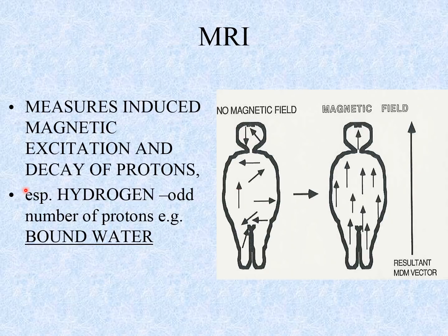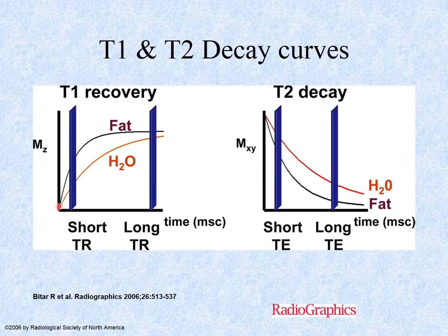Hydrogen is included. If you put the body in a field that has a very strong magnetic field, all of those bound water molecules are oriented in roughly the same direction. If you disturb those briefly, as you might a compass when you hit the needle, they will gradually reorient to the orientation of this field, and it's possible to detect that over the next period of time and show the relaxation of those molecules back to the point at which they originated.